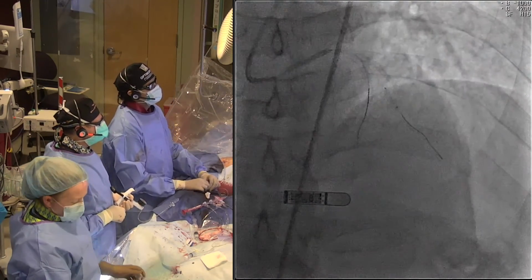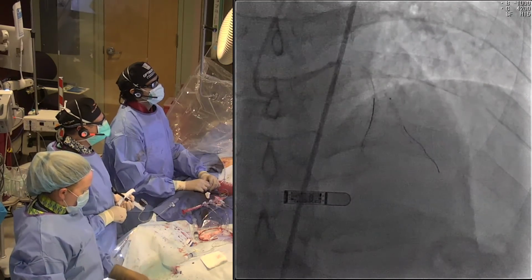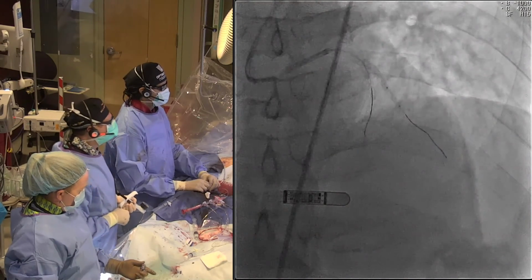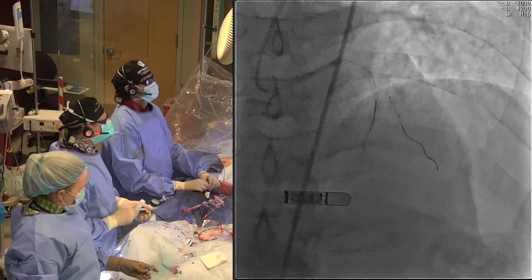So another nice example. Let's go up. I think you're a little too distal. Come back just a tiny little bit. Yeah, nice. The stent boost. Can we show the stent boost on camera, Craig? The stent boost really helps actually to see where we are. Let's take that, guys. It's perfect.